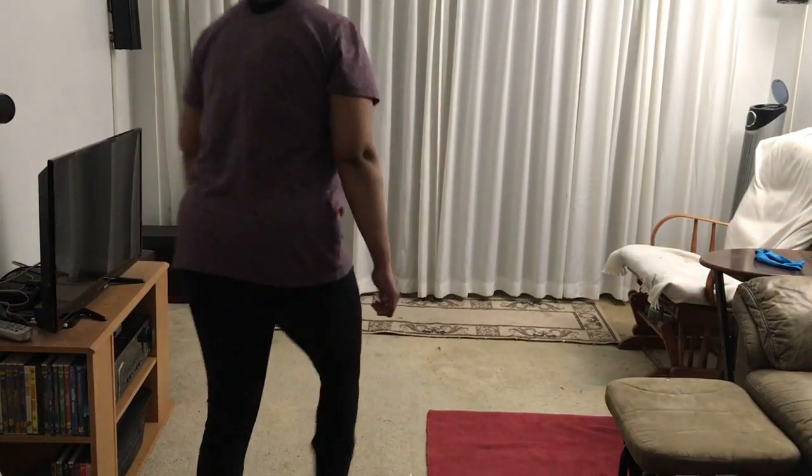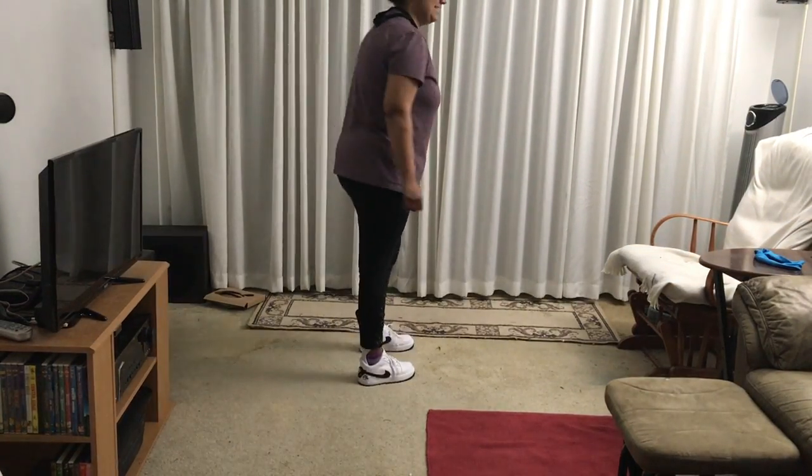There we go. And I'm turning. Turning. Can't turn very smoothly. There we are. And turning again.